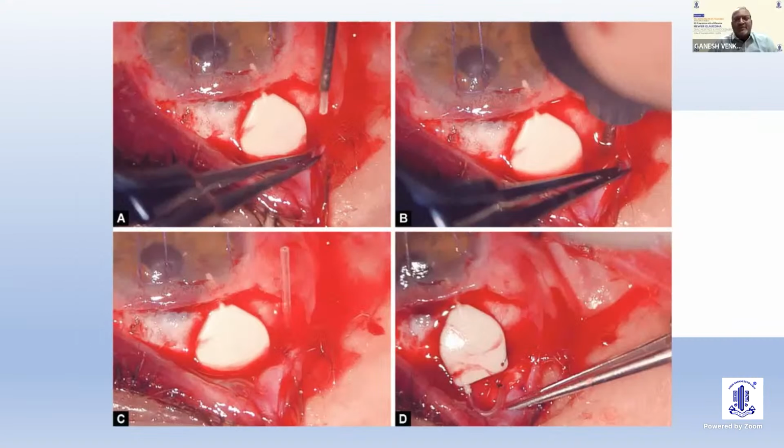This is how the image appears in the publication, and you can see the implant being connected to the plate. You can use a lot of devices like the Ahmed glaucoma valve, the Baerveldt implant or the Molteno implant. Any type of plate can be used. You don't have to use any proprietary plate. You can use a valved or a non-valved device also.